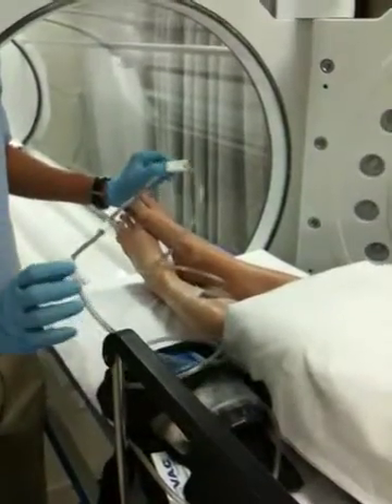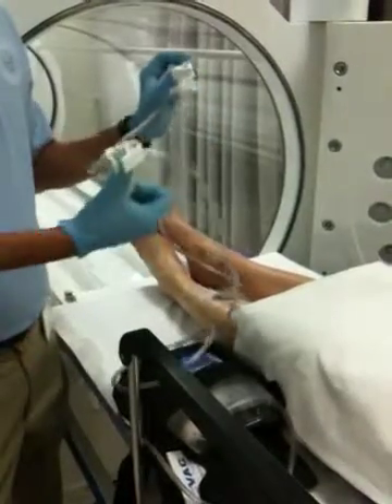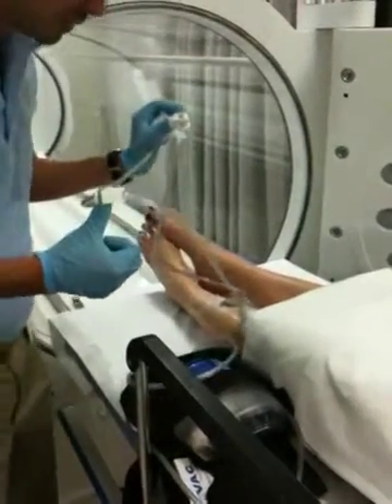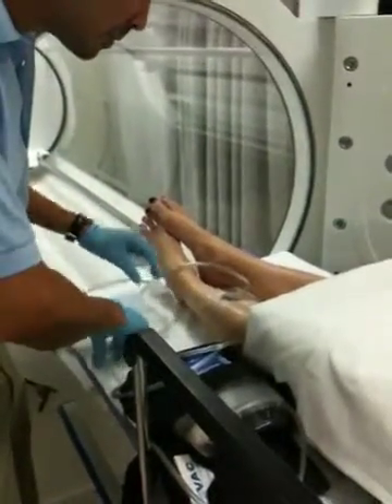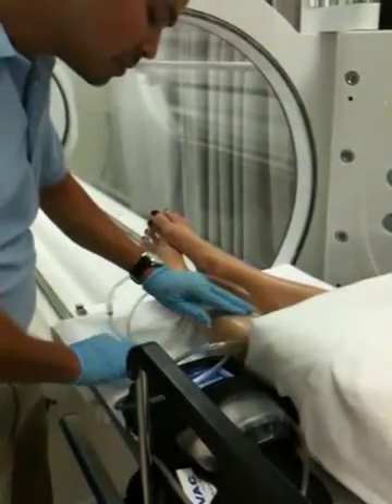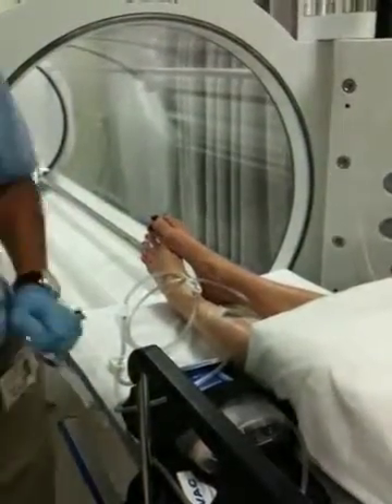It's a good indication that the vac wasn't actually working until you unclamp these hoses — good lesson for everybody. We're at 125 millimeters of mercury.